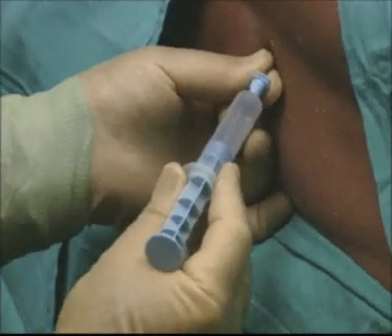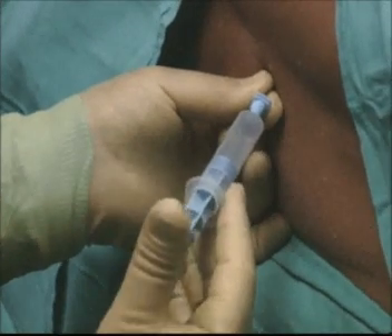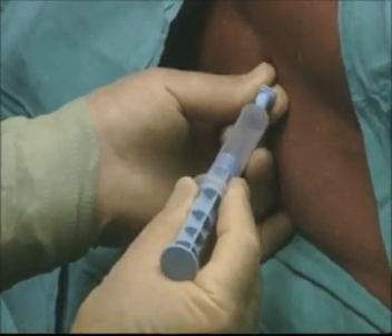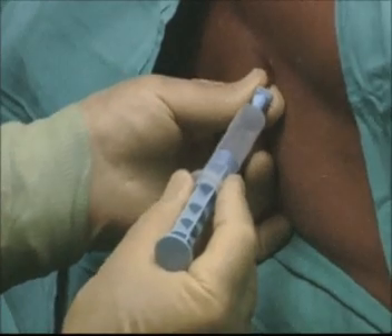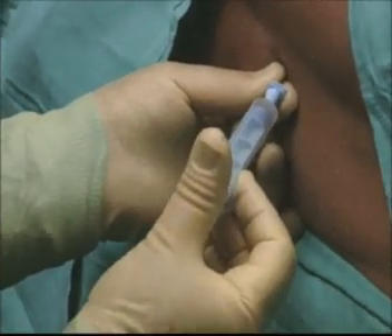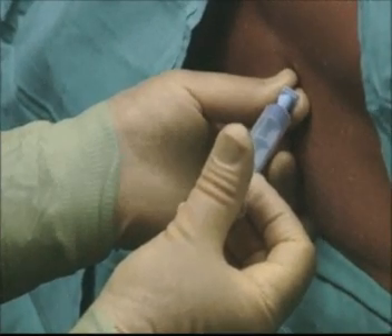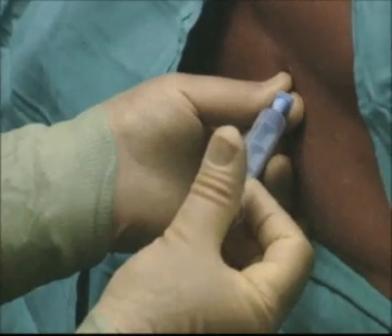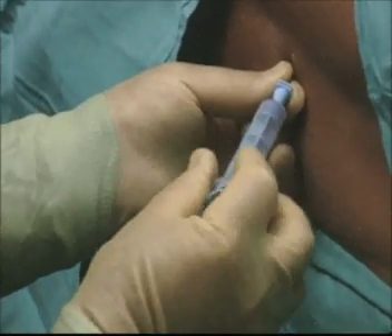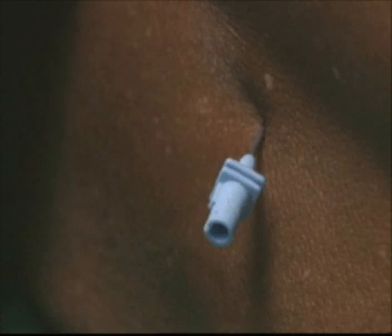Under controlled conditions, the needle is advanced carefully. As the needle moves forward, the plunger of the syringe is periodically tested. Once the ligamentum flavum is passed, a sudden loss of resistance is felt, and the syringe plunger can be depressed with the air entering the epidural space. This confirms the correct location of the space. The marks on the needle indicate the distance it has entered the body, which in this case is seven centimetres.